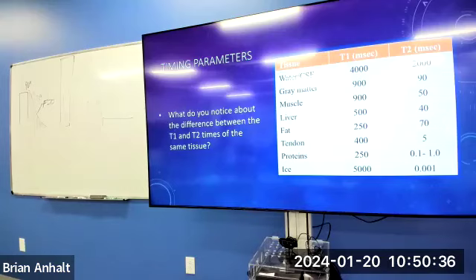A typical knee scan is an axial proton density, 2 sagittals, 1 T1 and 1 T2, and 2 coronals, 1 T1 and 1 T2. So 5 sequences total, about 3 minutes each. So 15 minutes of scan time. It can be faster or slower depending upon your equipment.